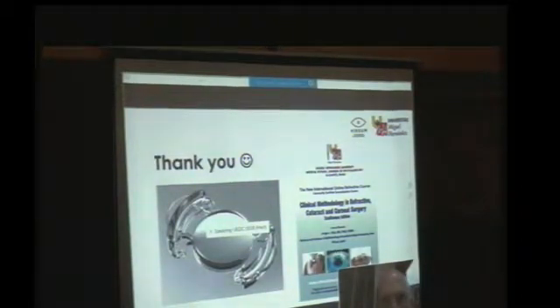So I cannot answer this question. The lowest power that we have implanted is 10 diopters, so this lens works well in high myopes, but we have no case with plano lens, which is very important because it might be that these plano lenses could be implanted on top of previous lenses to gain accommodation, might be.